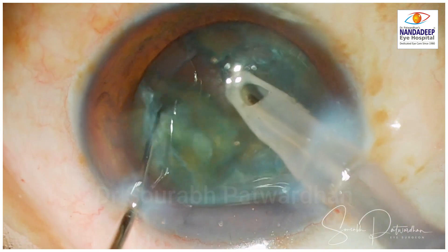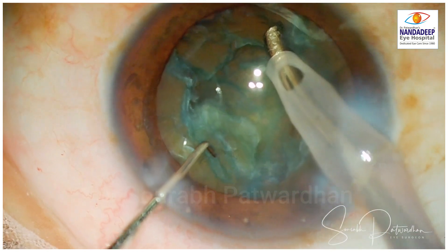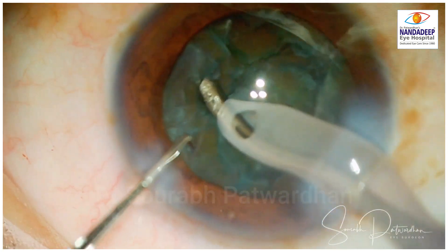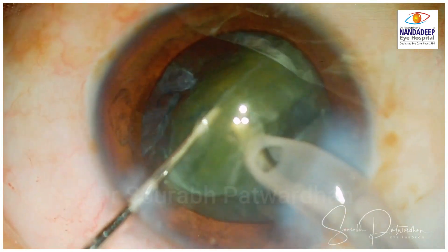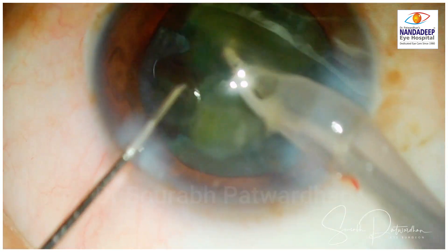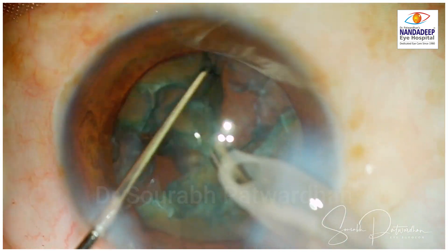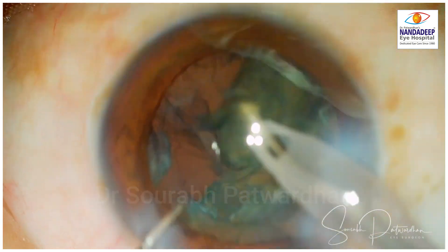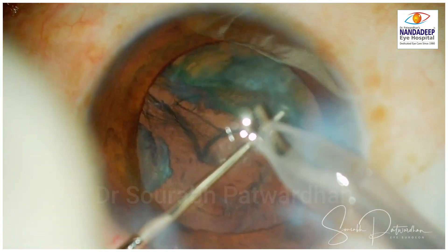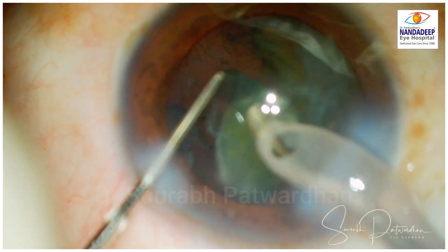The idea is that at least one pole should be out. You can do it by trench divide and then pulling out one edge of the quadrant, or otherwise if you are stuck, you can do hydro prolapse. Here I could prolapse one quadrant out and that's it. We don't require much phaco energy here — it's more of aspiration. The key is to bring one piece out of the bag, which gives space, and then the rest of the pieces you can just prolapse and aspirate. That's how you should deal with these cases of cortical soft cataract.